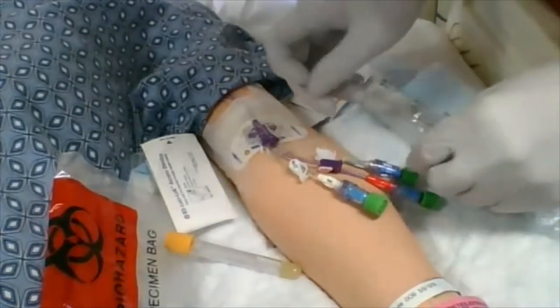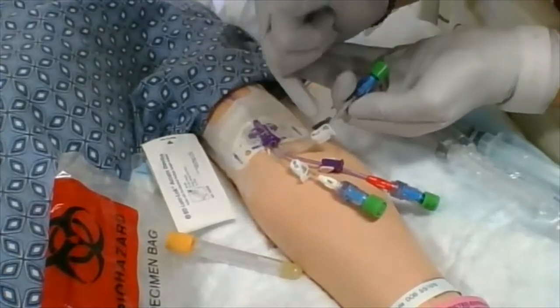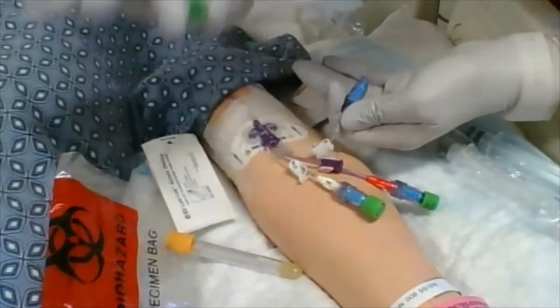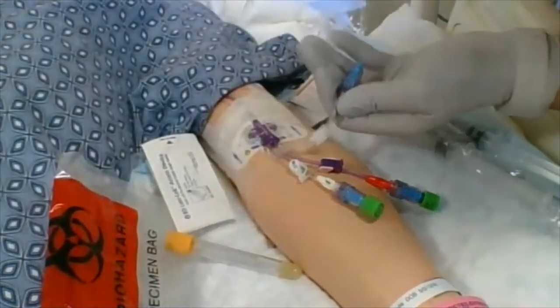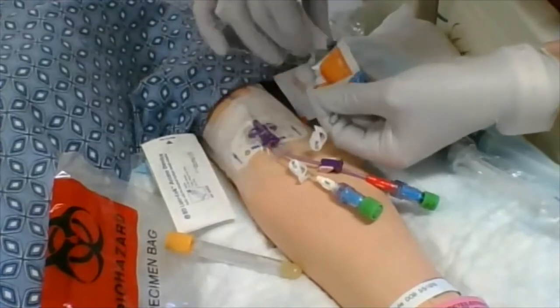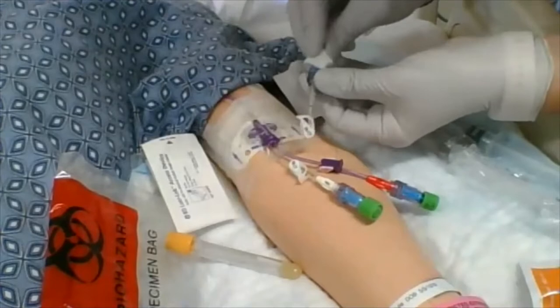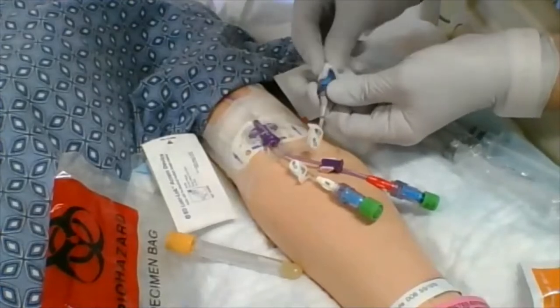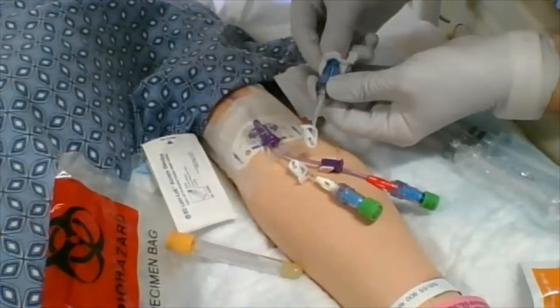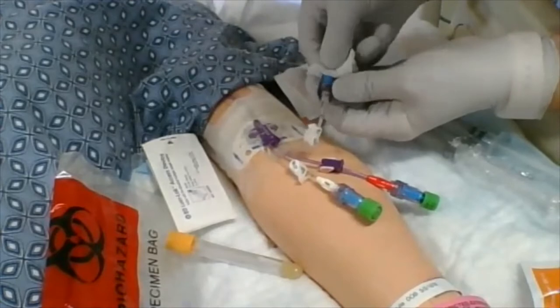First thing I'm going to do is take my port here — it is clamped. I'm going to take off my Kuros one-time use cap and throw that out. Grab an alcohol wipe and go ahead and scrub the hub for 15 seconds.